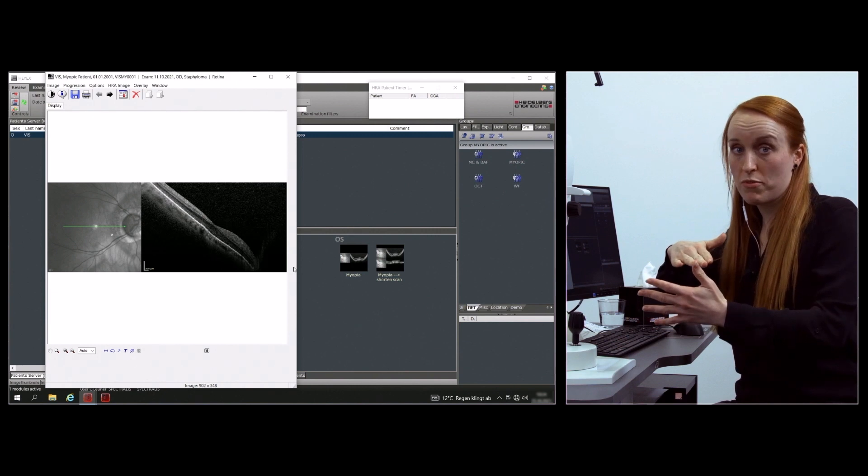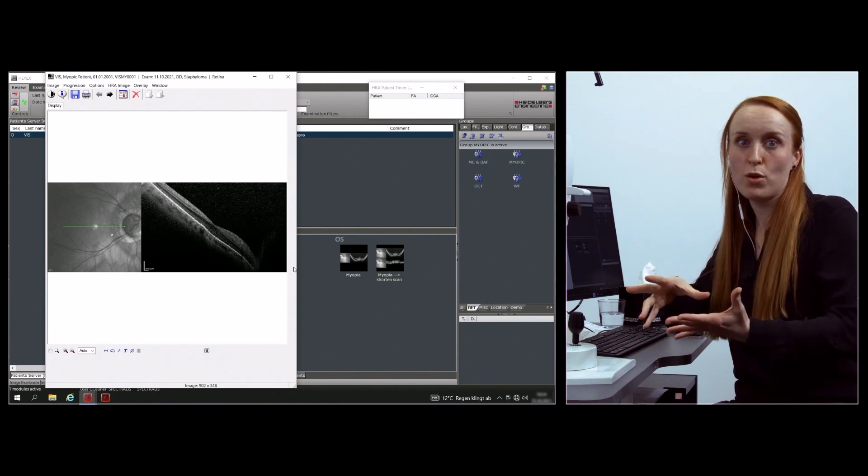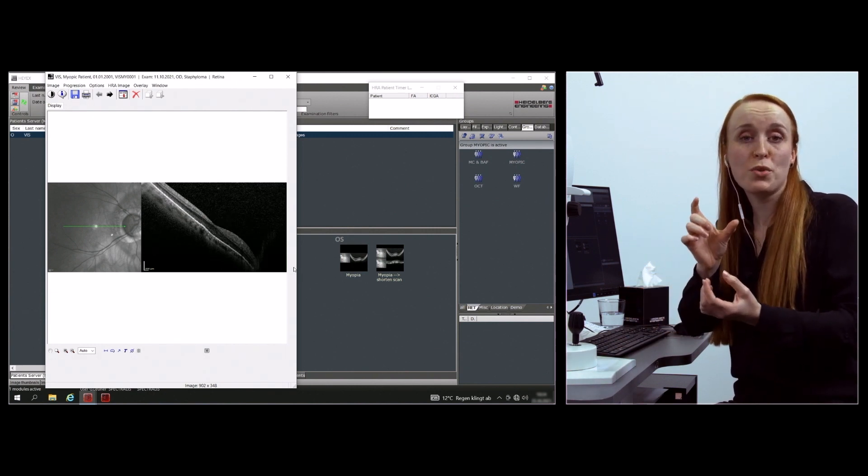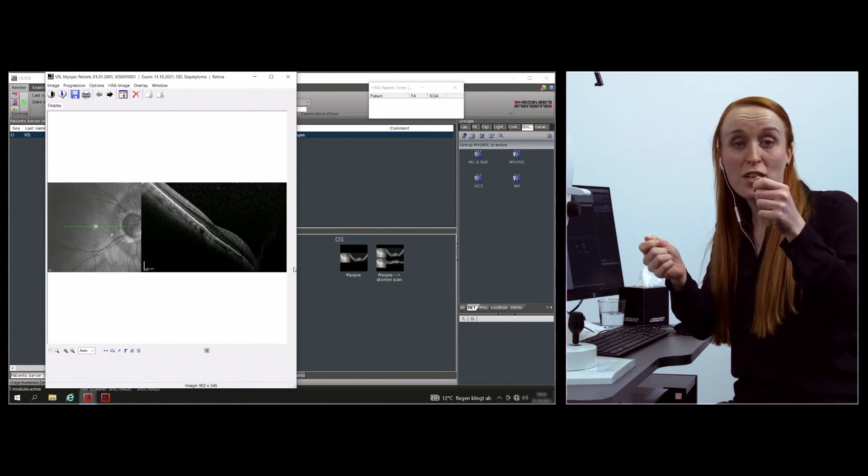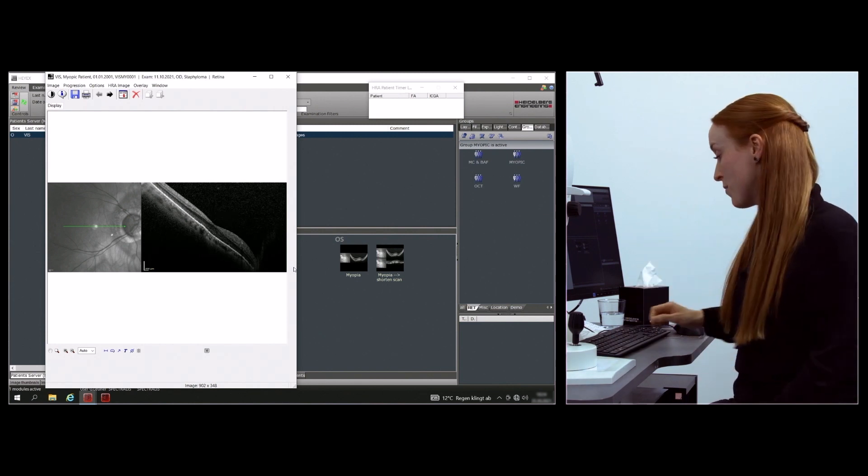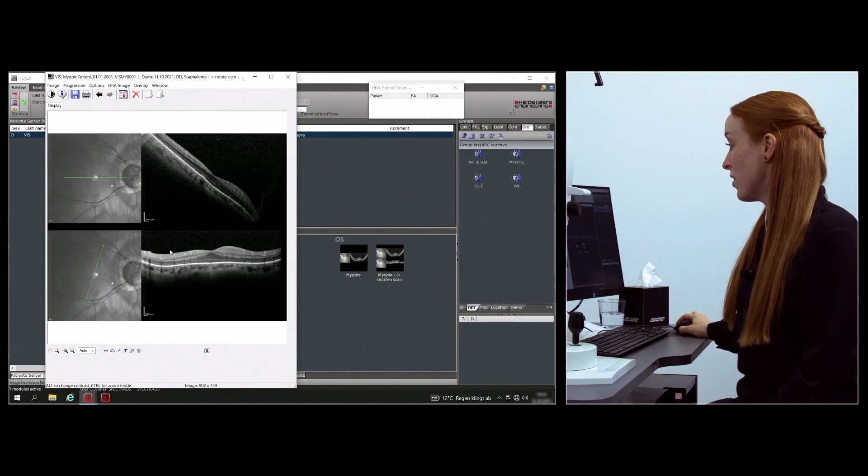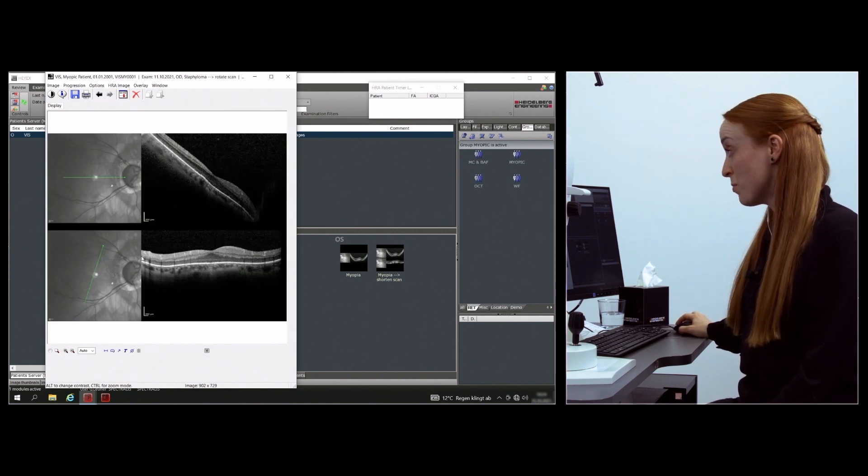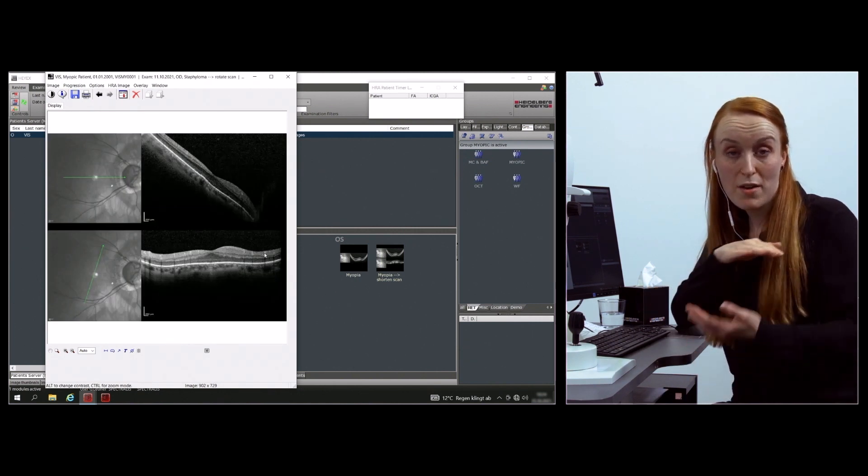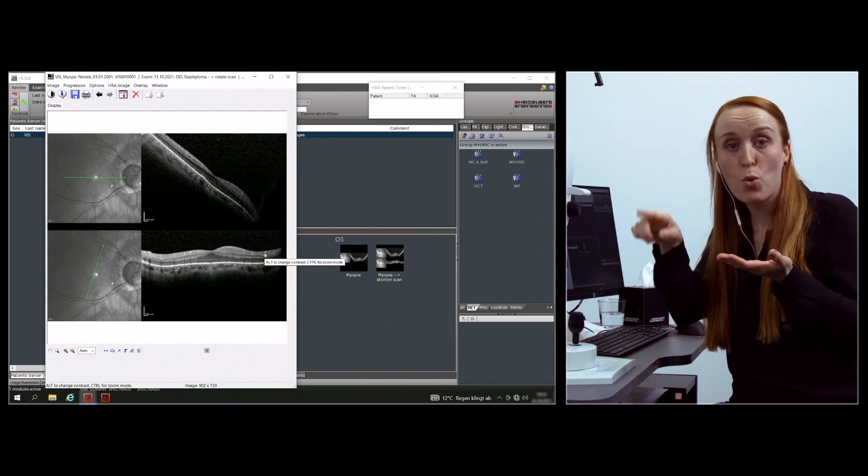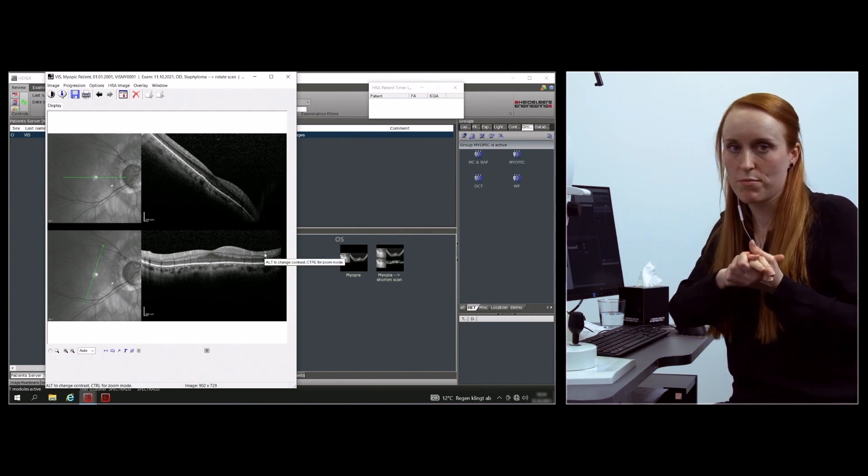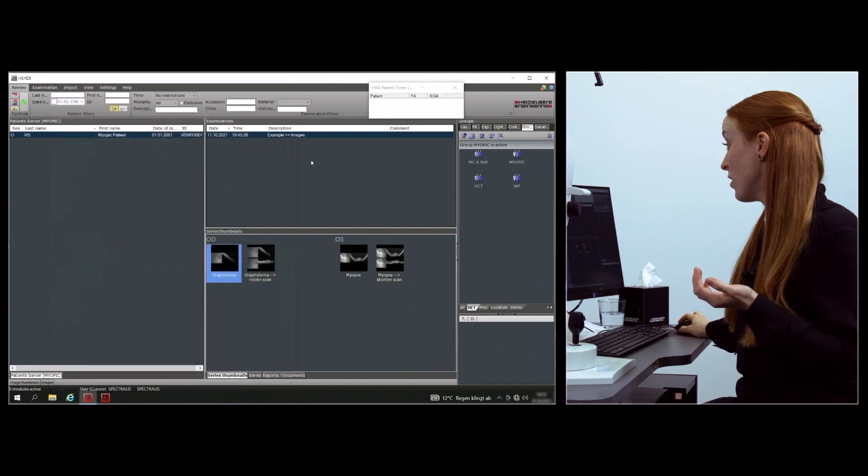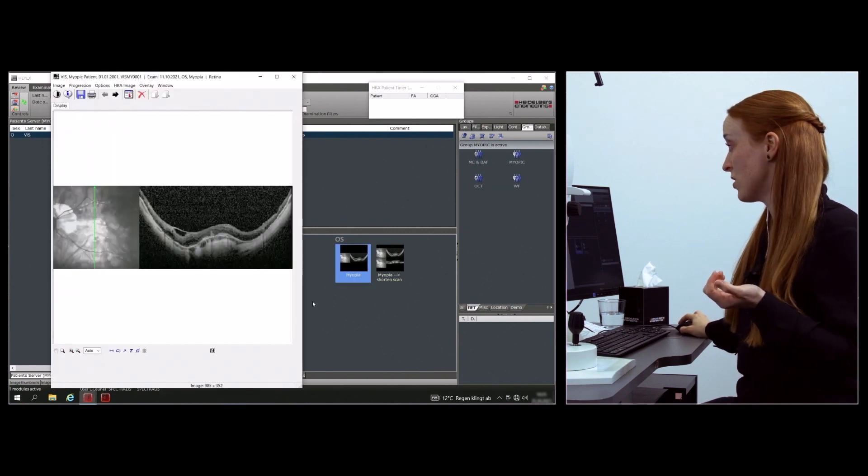But it's not fine in Staphyloma. What you can do here is just change the direction of your scan like this, and then you'll be able to see everything in one line again and have no blurry side of the OCT scan.